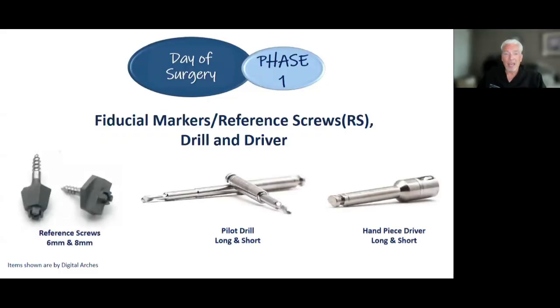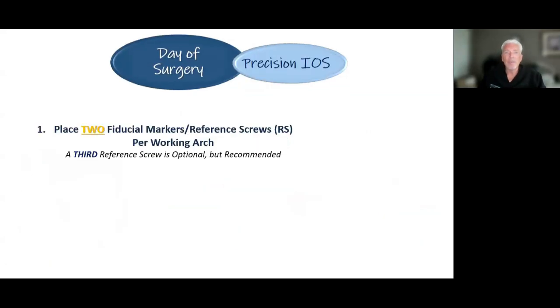Sorry, I just had a duplicate slide there. You need a drill; there's usually, not always, a corresponding drill. And then there's a driver here that fits over this for driving it. Different systems may have different ways of doing it, but that's pretty simple tooling for this.